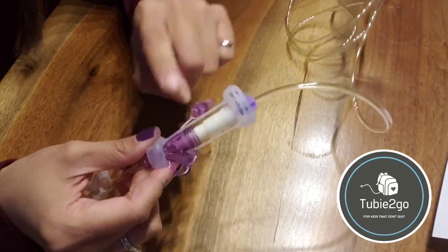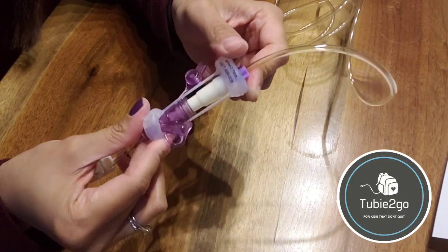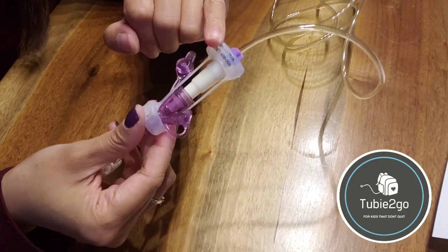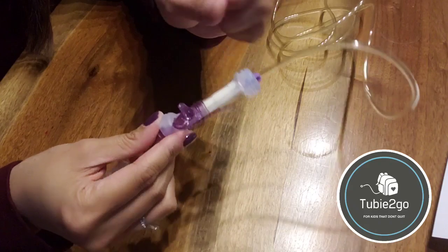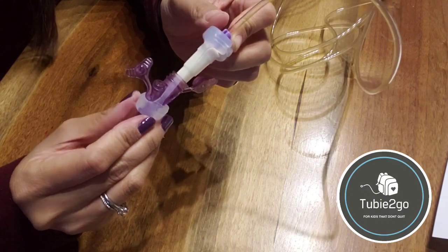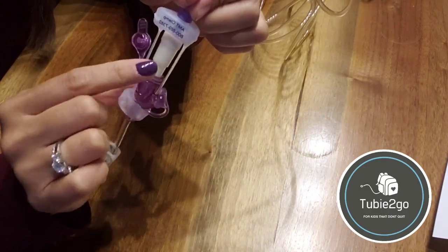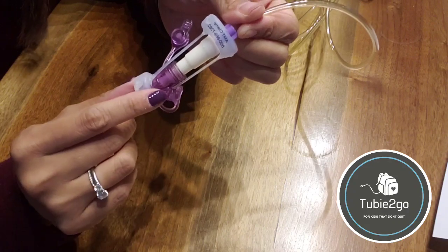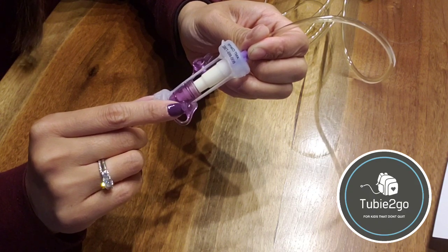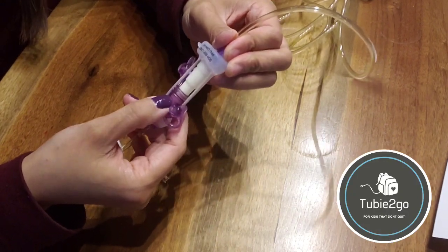So this is very stretchy. Again, it's silicone, but it does have a lot of pull to keep the two ends secured together. My one comment with this is that if one of the reasons that you're feeding the bed is the med port opening up by accident, then this AMT clamp is not going to be the proper solution. It will only avoid the two ports from disconnecting, not the med port from opening up. So a Tubieguard or a port cover might be a better option if the med port opening up is one of the reasons that you find yourself feeding the bed.